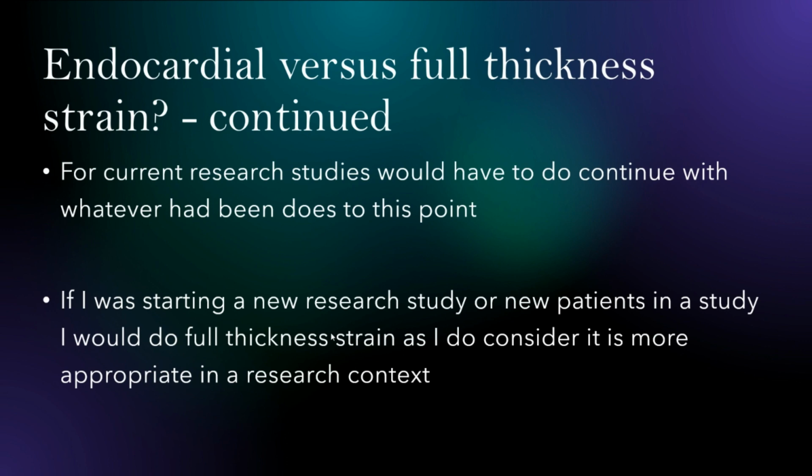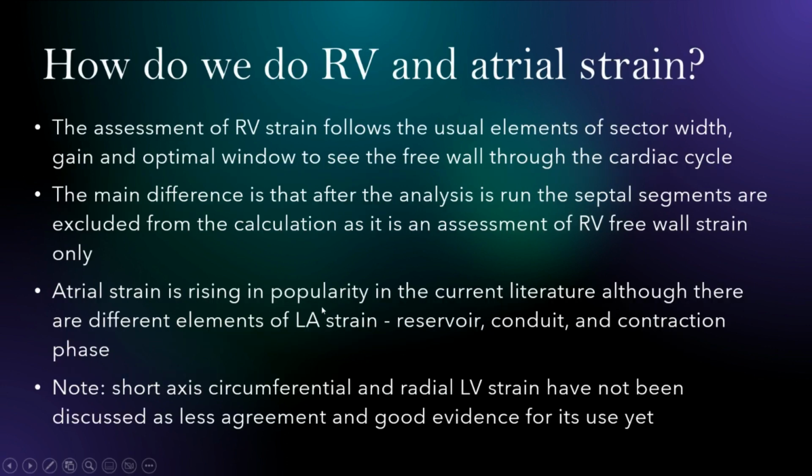If I was doing a study, well, current research, I will continue whatever I've been doing to this point. If it was a new study or new patients in the study, I would consider doing full thickness, because I think it's more appropriate in the research context, because there's just more information they can play with down the track in terms of analysing.